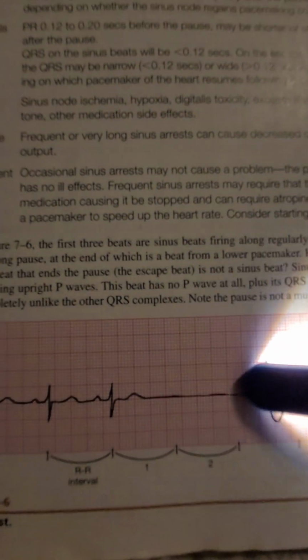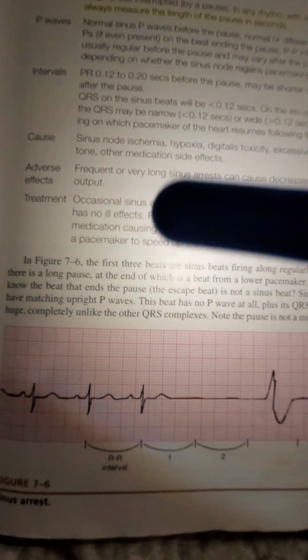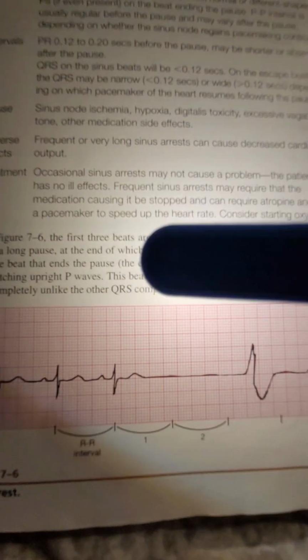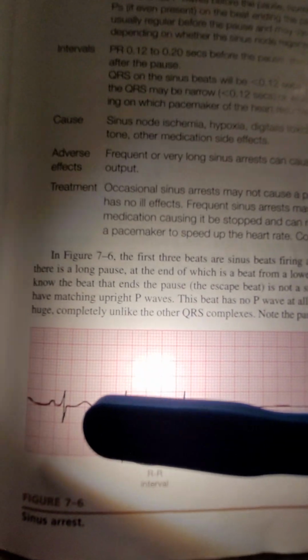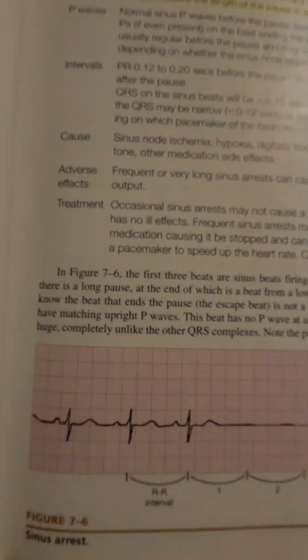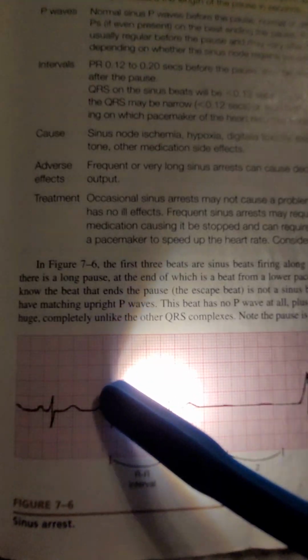No, you might have other stuff. You might have multiple PVCs, frequent PVCs. You might have frequent PACs. We'll learn that together throughout the book so you can have an idea. But usually most rhythms are sinus rhythms, but you'll have some with stuff in there, and you have to just make sure to say the underlying rhythm, and then what else do you see in that rhythm?